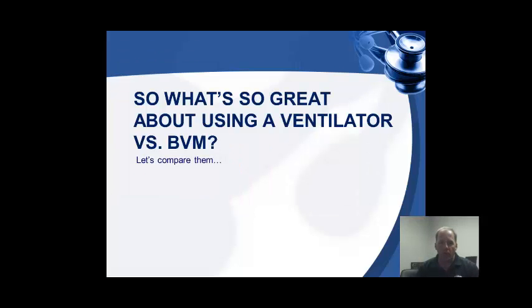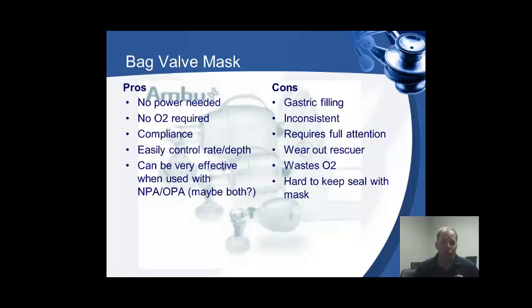Alright, so what's so great about using a ventilator versus BVM? We've used the BVM for a long time. If you've been in the business at all, you've used it a lot. Okay? It works really good. You don't need any power. You operate it yourself. You can feel the compliance. You control the rate and the depth of respirations, and it's really effective.